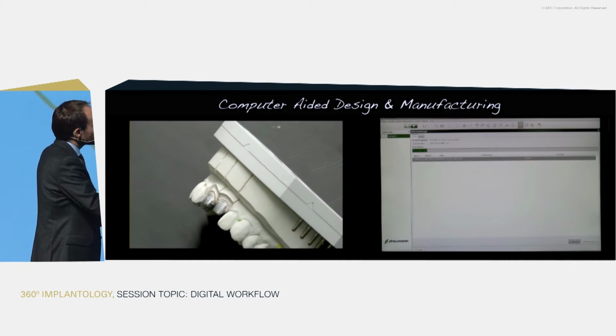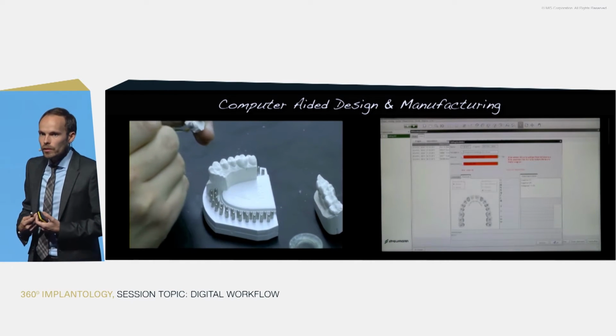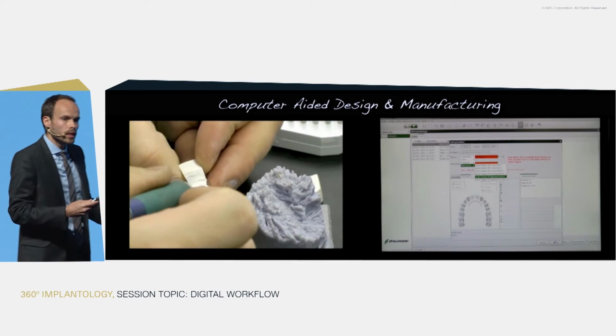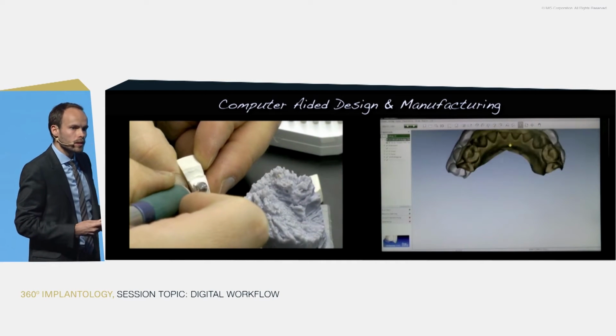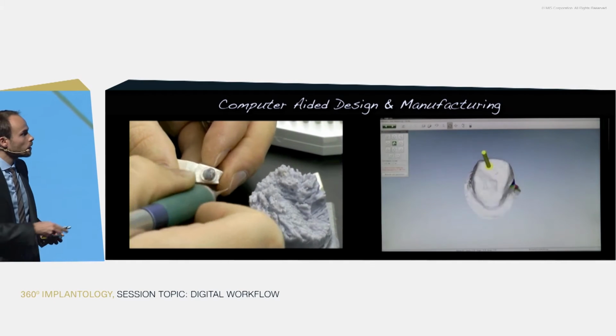The same, once again, when it comes to the design, because what we technicians love to do is waxing, but here you will see that I invest 10 to 20 minutes of my time just physically waxing material in order to get the new contour of the crown.